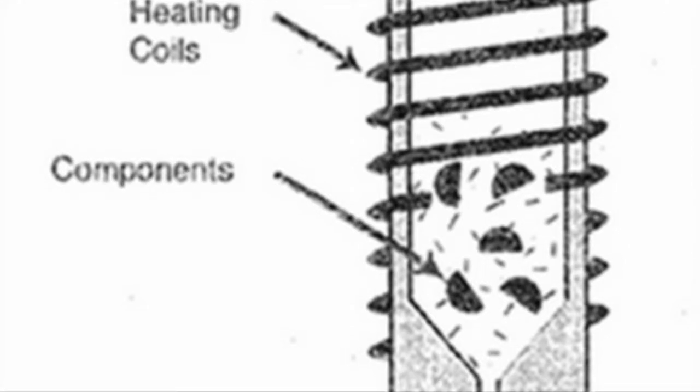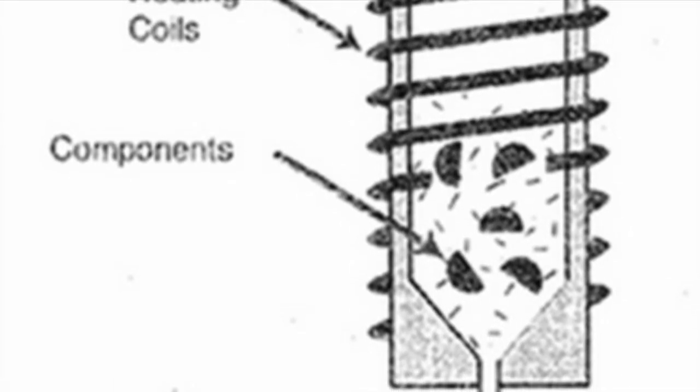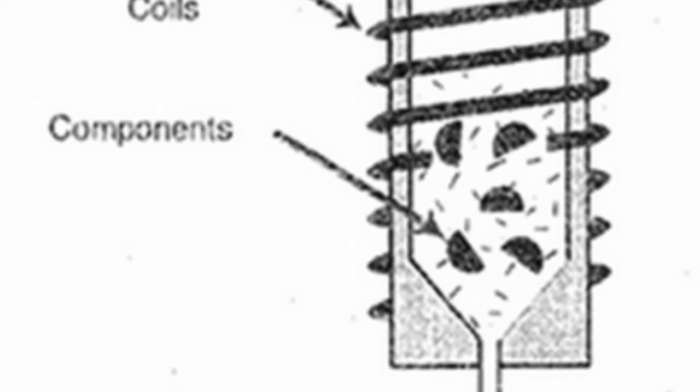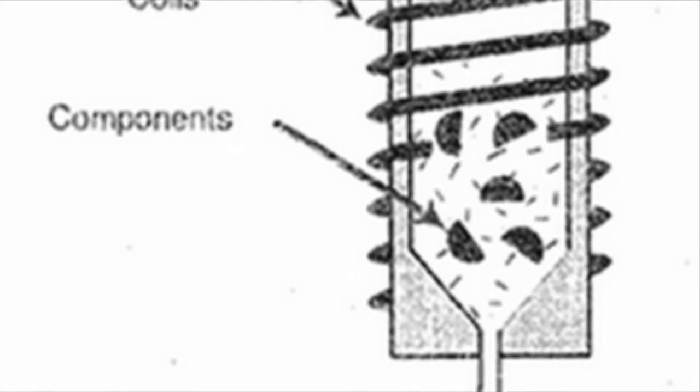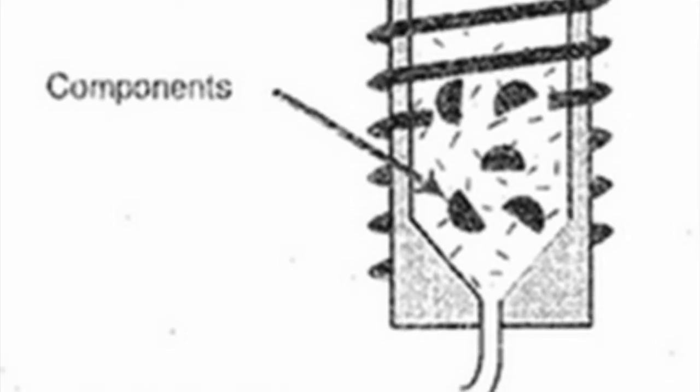At such high levels of heat, often approximately 1300 centigrade, the deposition process follows fairly readily, but without this high heat, the adhesion is nearly impossible. This final step of recrystallization following vaporization is referred to as pyrolysis, hence the name pyrolytic carbon or pyrolytic graphite.